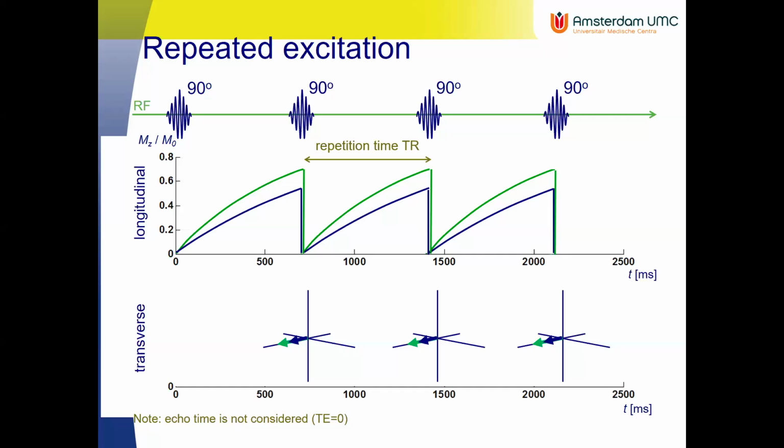And what I didn't explain, but you would have to accept as a fact, is that my antenna gets a signal which is proportional to the length of that vector in the transverse magnetization. So I have a detectable signal difference between the gray matter and the white matter there. Is that answering your question?